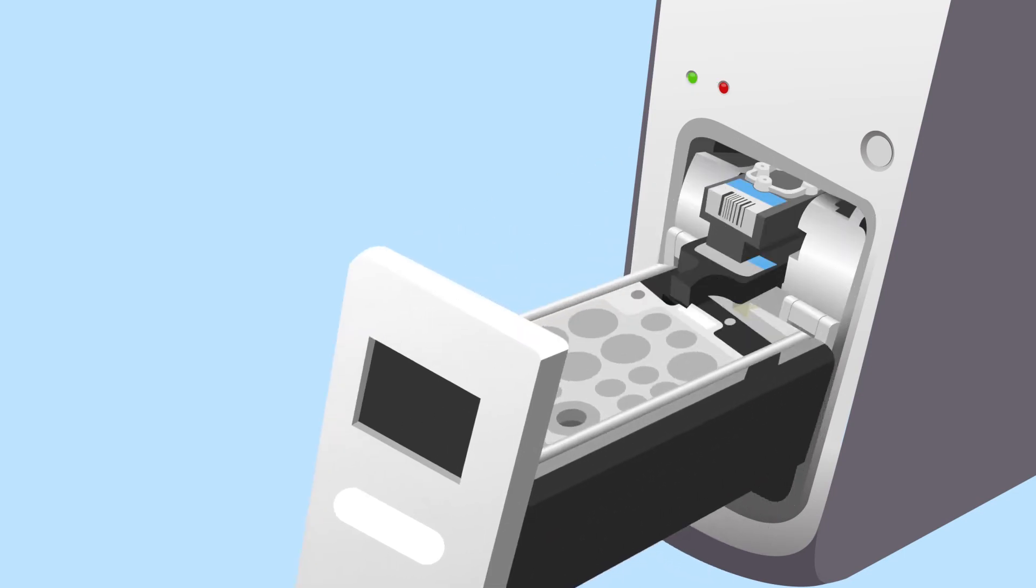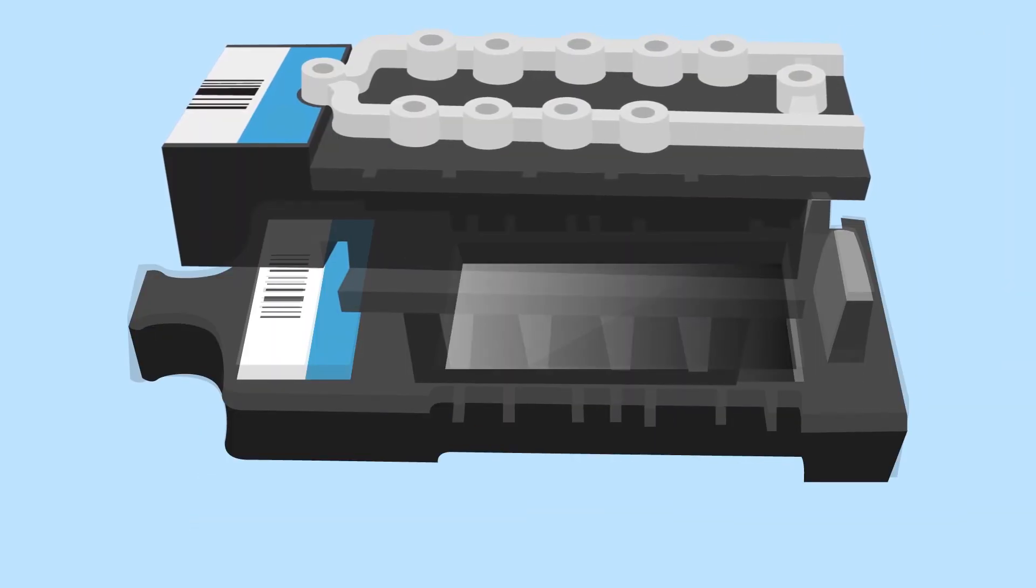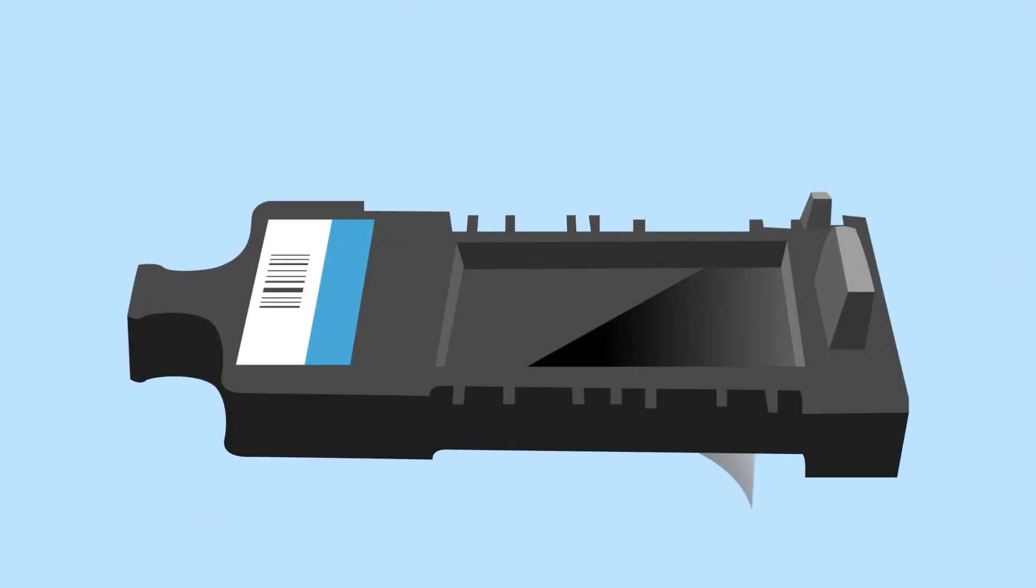When sample processing is complete, remove the test cartridge and separate the test substrate. Remove the protective tape and place the test substrate on the Verigene Reader for the final analysis step, which takes about 10 seconds.